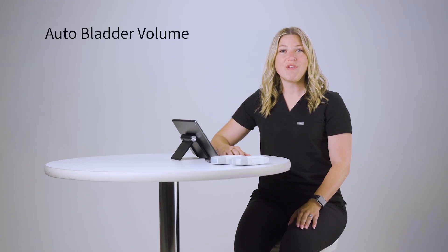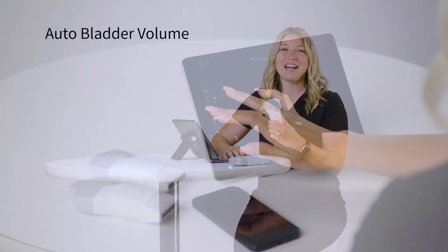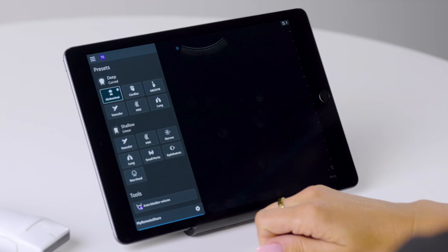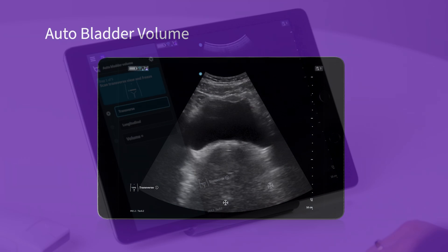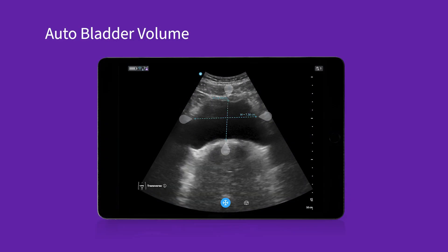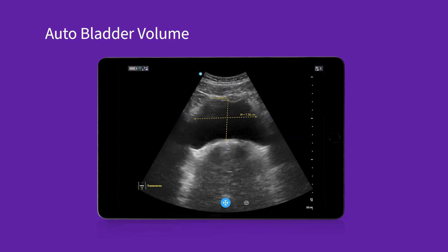Second, we now have auto bladder volume. You asked for it and it's now available on vScanAir CL. Say goodbye to manual measurements and calculations. Our smart AI algorithm automatically detects bladder borders and measures bladder volume. Unlike other devices on the market, it allows for clear visualization of abdominal fluid while measuring, so you can fully assess the bladder to make the most informed clinical decision.